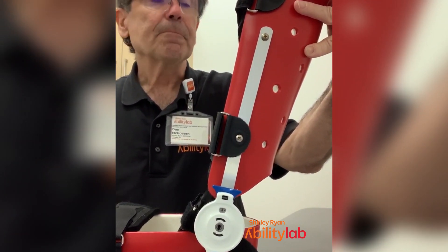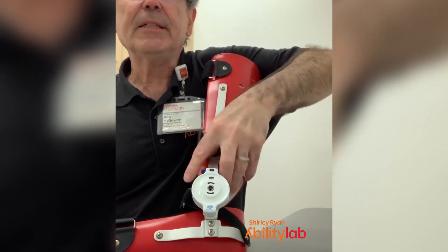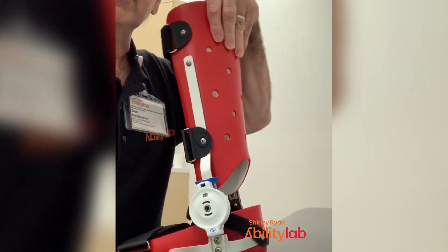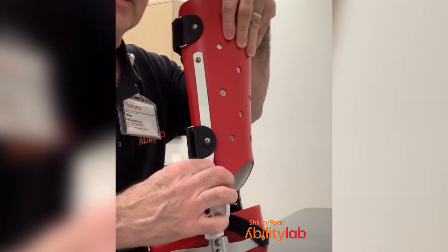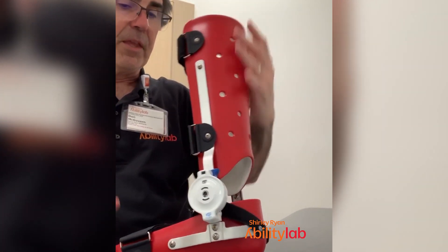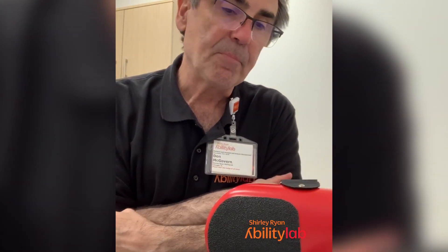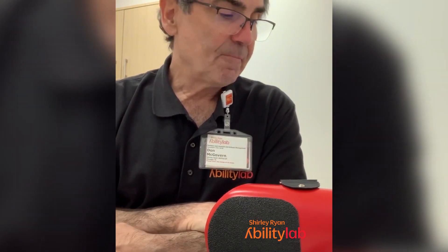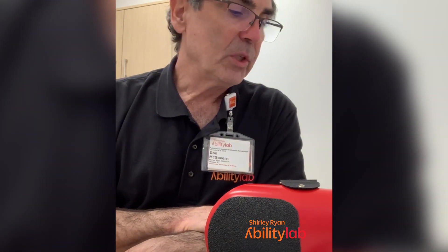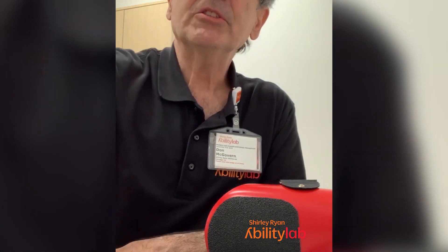That's the very basics. To remove it from a person, sometimes people like to lock it first. The locking takes a little getting used to — if you can jiggle it a little bit and move it, it usually goes in there much easier. I hope that's helpful. We're going to hopefully do a telehealth follow-up or an in-person follow-up. If you have any questions, feel free to call and you will have that information sent to you. Thank you so much, bye-bye.